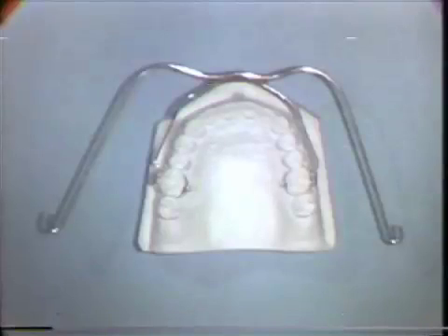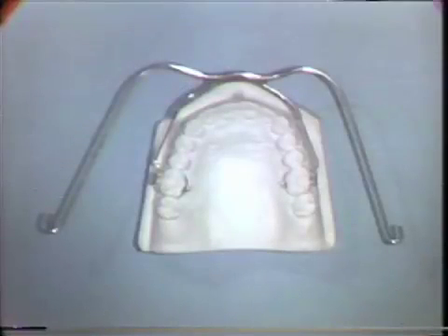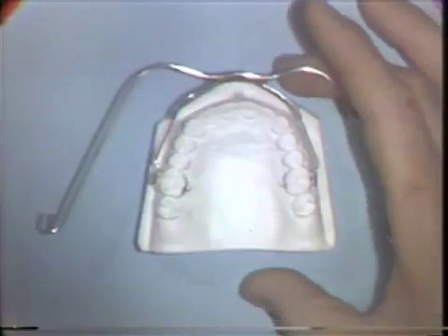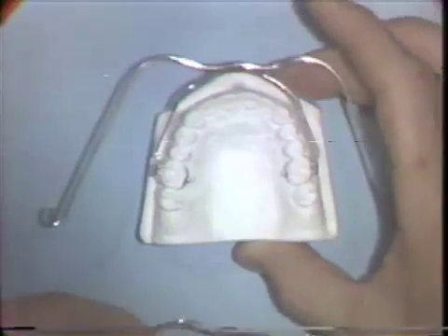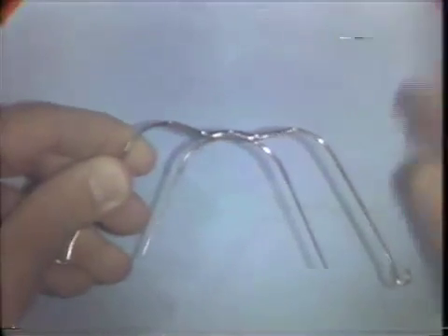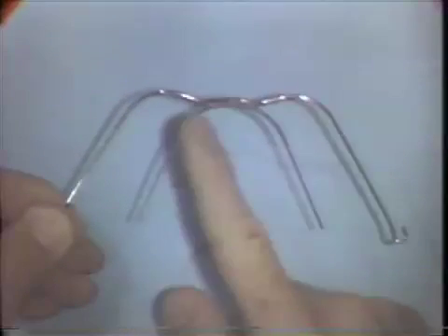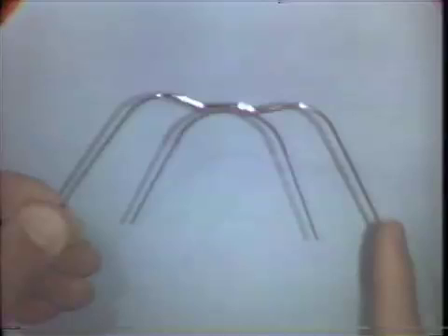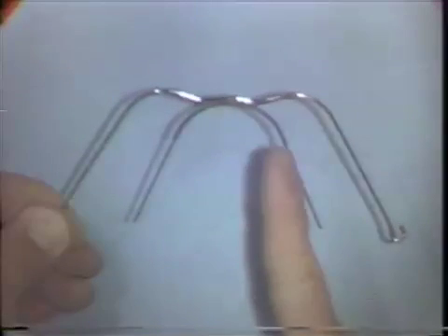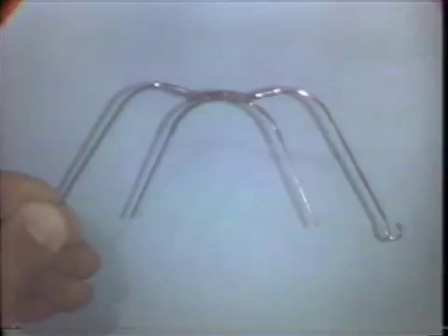In this presentation, I'm going to demonstrate a wire bending technique for Facebows. Facebows come pre-formed from the manufacturer to some extent. They consist of two parts, the inner bow and the outer bow. The inner bow is the section that requires all of the wire bending.